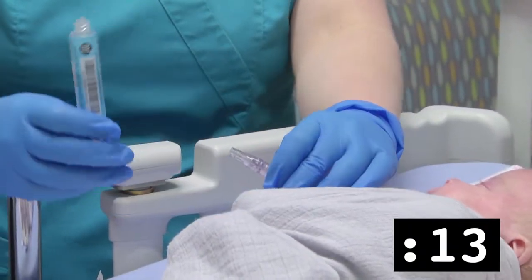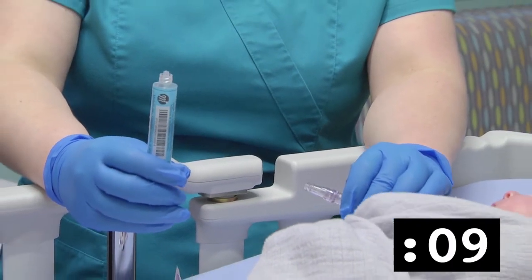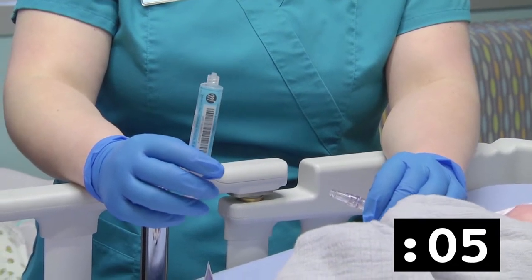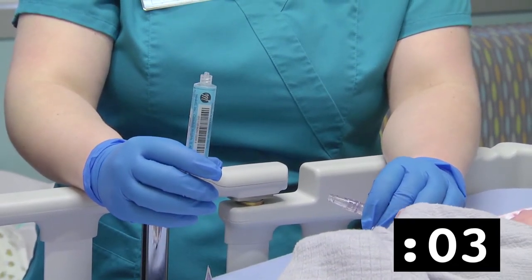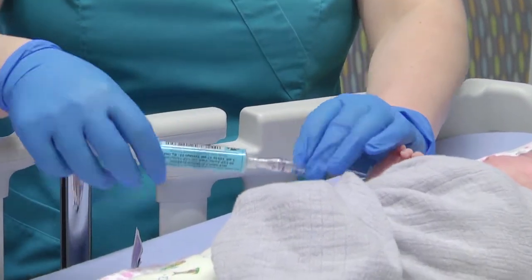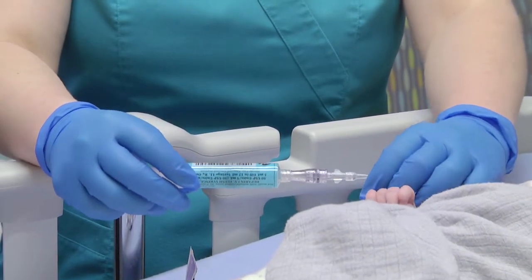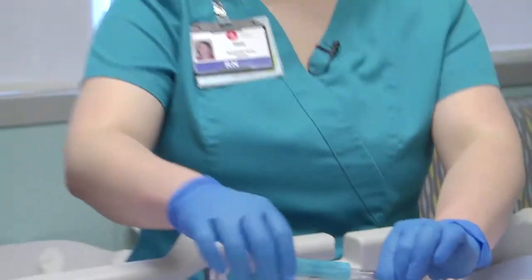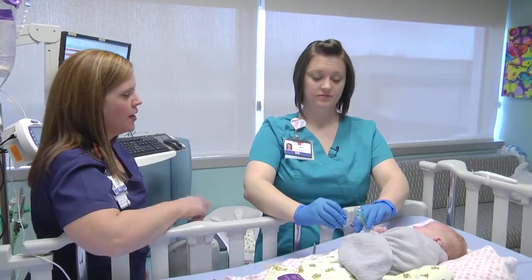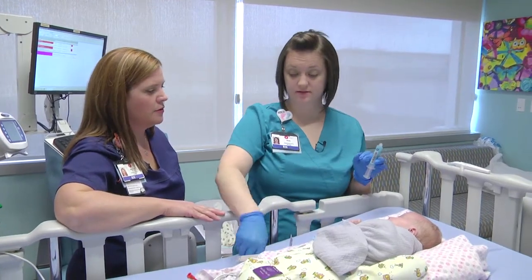And again, we're going to let this dry for 15 seconds because alcohol needs to be completely dry in order for it to be a disinfectant. Okay. Great job. Gonna get my new cap. And if that cap's on, how long does it need to be on? For at least 5 minutes. Great.